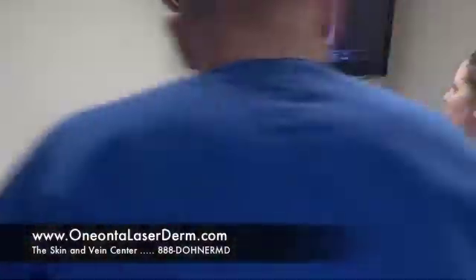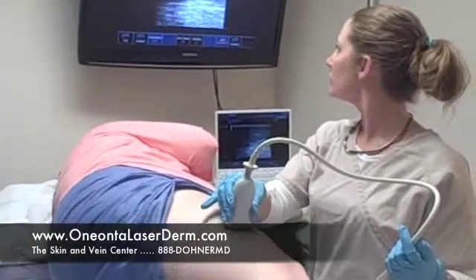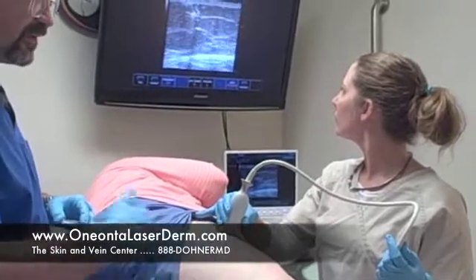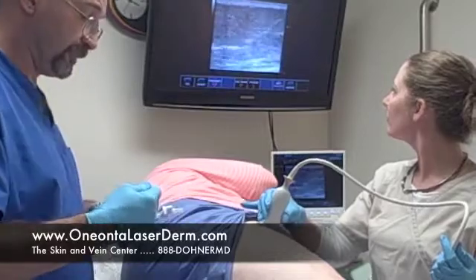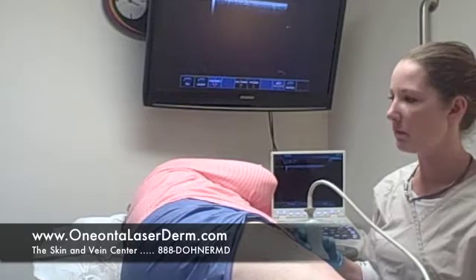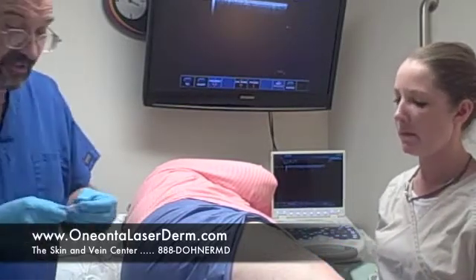Now we'll do some surface sclerotherapy. We'll be using the same medication and injecting it on this vein that goes down the thigh. How are you doing there, willing victim? I'm fine. How much did that burn or hurt or ache? Actually, it didn't hurt at all. She barely felt anything except the little poke of the needle.